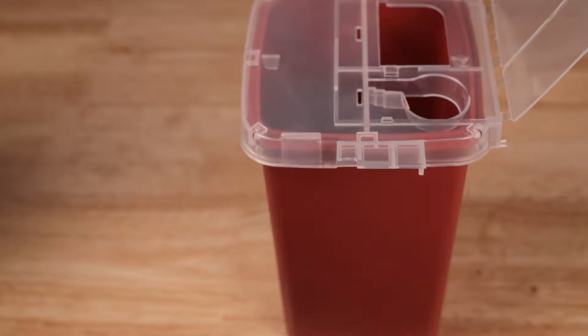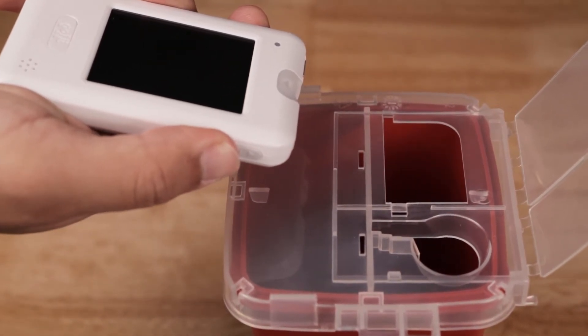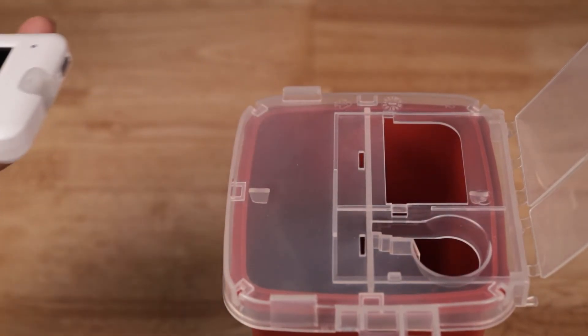After the meter prompts you, remove the used test strip by sliding the eject button on the side of your meter and dispose of it in accordance with your local waste regulations.